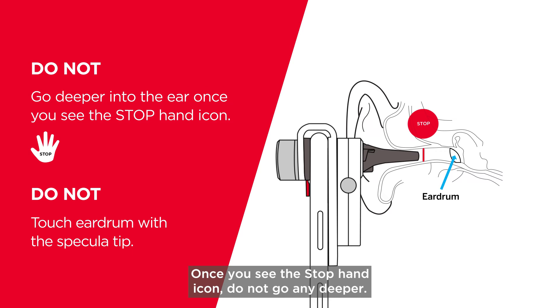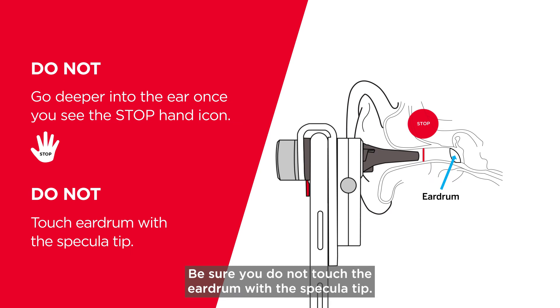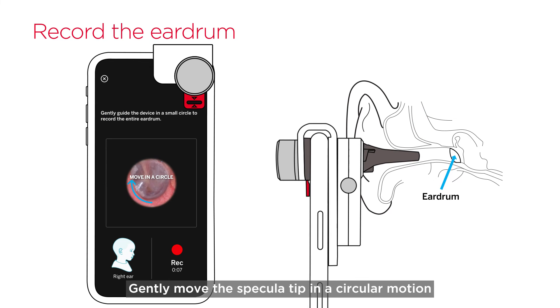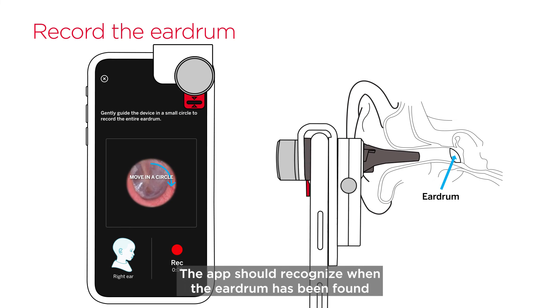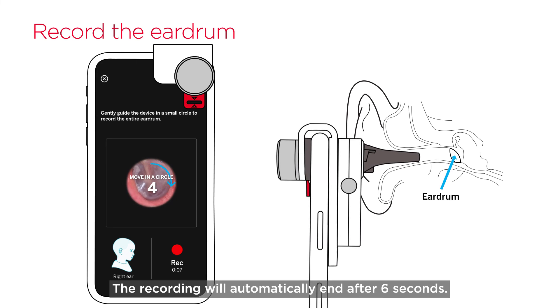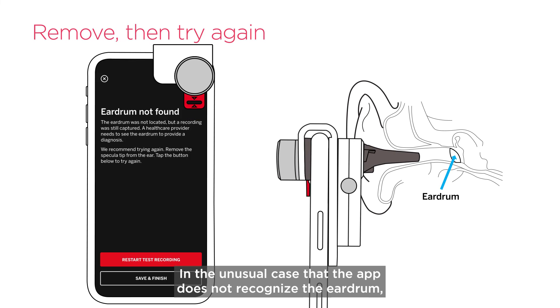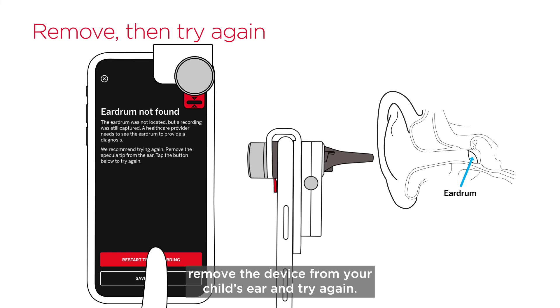Once you see the stop hand icon, do not go any deeper — the eardrum has been found. Be sure you do not touch the eardrum with the specula tip. Gently move the specula tip in a circular motion to record a video of the entire eardrum. The app should recognize when the eardrum has been found and will begin a countdown. The recording will automatically end after six seconds. In the unusual case that the app does not recognize the eardrum, remove the device from your child's ear and try again.